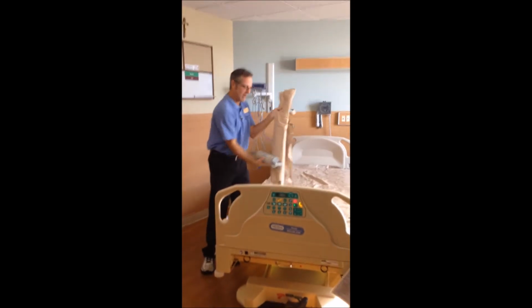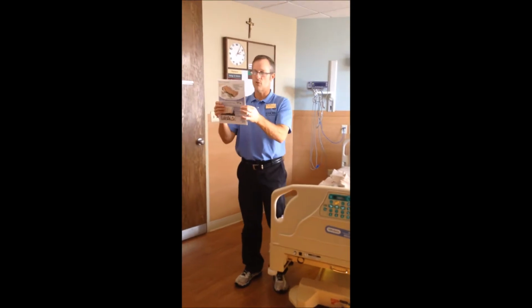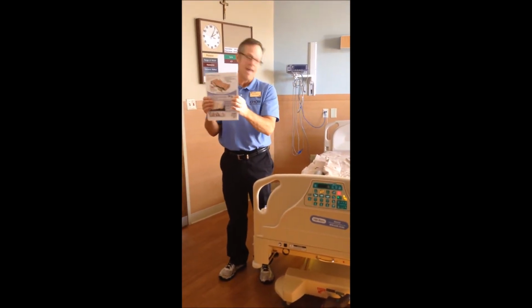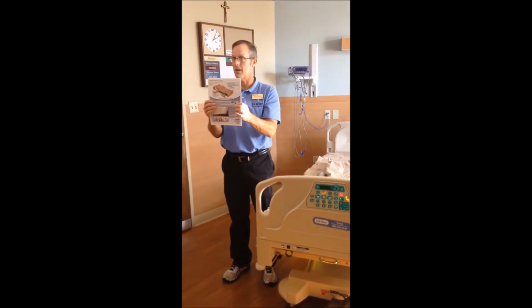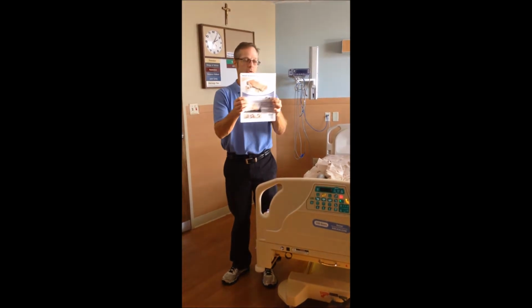You all will have a little electric inflator to use, and it's on this sheet. If you want to use the electric inflator, it takes about 10 seconds. That stays on the unit; you don't want to do anything with that. I use the hand pump. It takes me about 20 to 25 seconds, so it's just as easy for me with the hand pump as with the electric inflator.